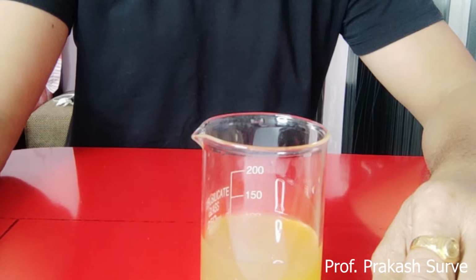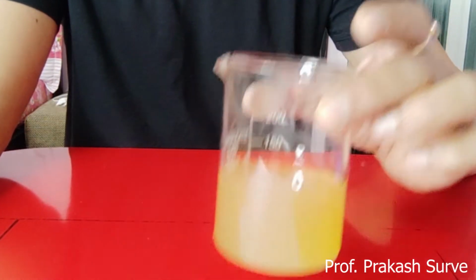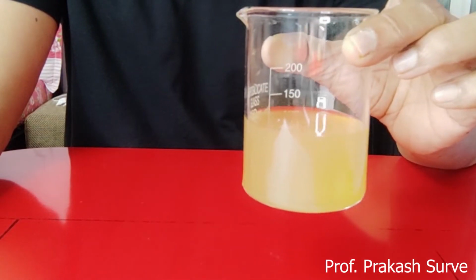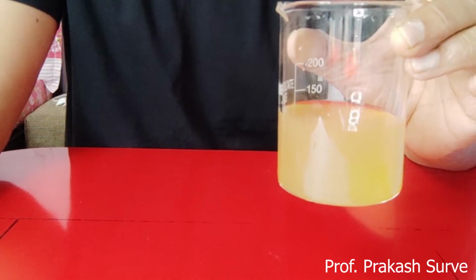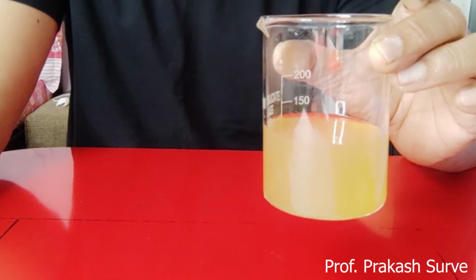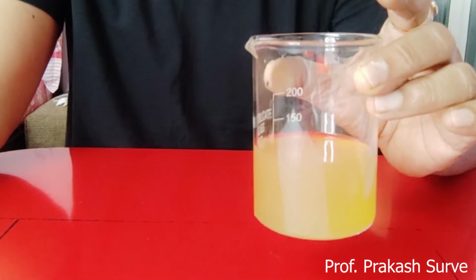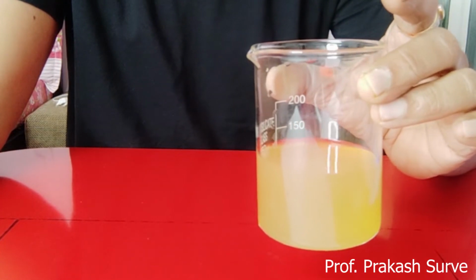Today we'll see the test of urine sample for its normal as well as abnormal constituents. So this is about the urine sample. Now the aim is to test the presence of urea, sugar, albumin and bile salts in this urine sample. Before doing this test, we'll just see what urine is.